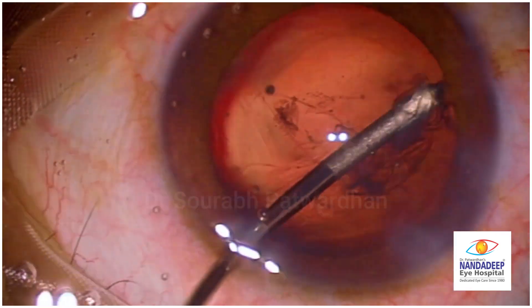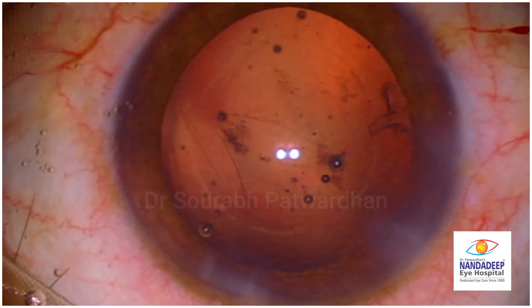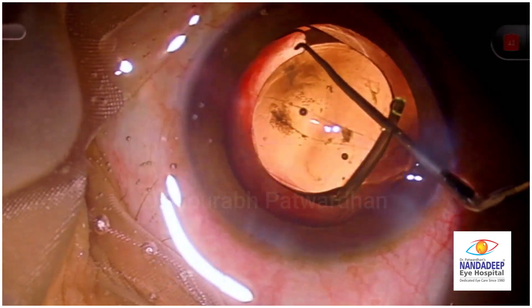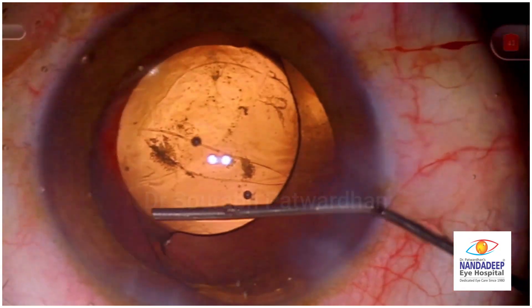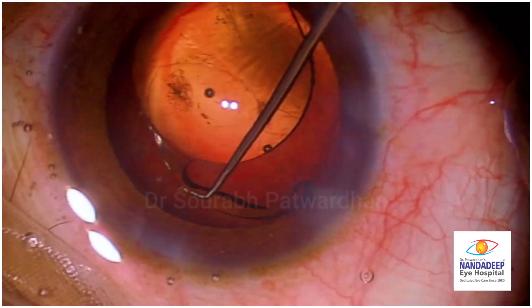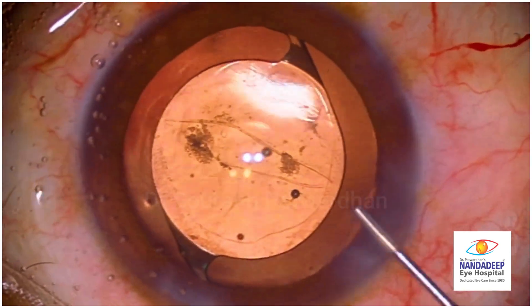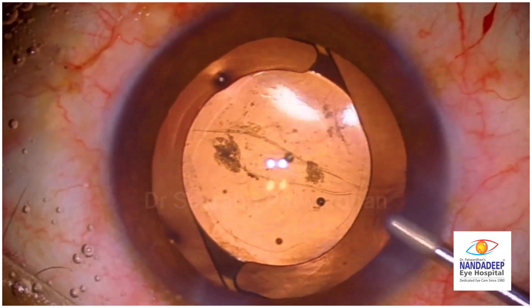So I need to be very careful and very gentle here. I decided instead of VISCO I am going to do dry aspiration — again being careful not to make the AC shallow. There is always a play between inflow and outflow all throughout during this surgery. Here, because the PC tear has not extended to the periphery, I decided I will place the IOL in the bag and rotate the haptics perpendicular to the direction of the PC tear. Luckily it is not a toric IOL so I can place it perpendicular to the existing PC tear. The most important thing is to dial the haptics very carefully into the bag, dialing them from the anterior capsule into the bag, and not to use gravity-based or even active fluidics to wash out the VISCO, because the anterior hyaloid may break.